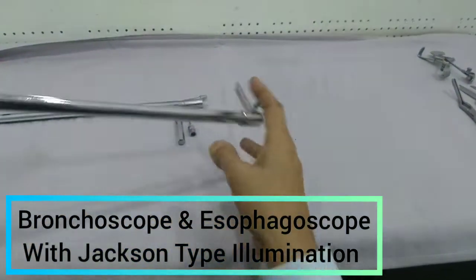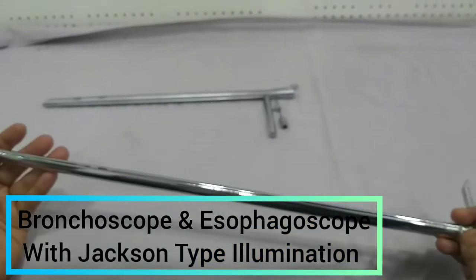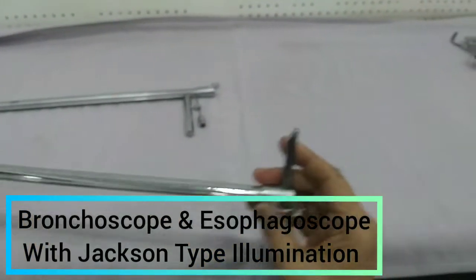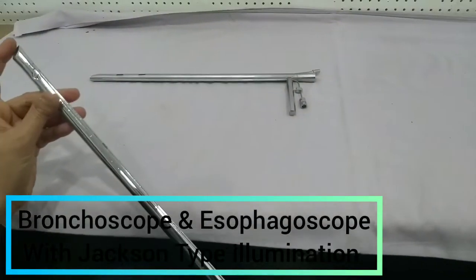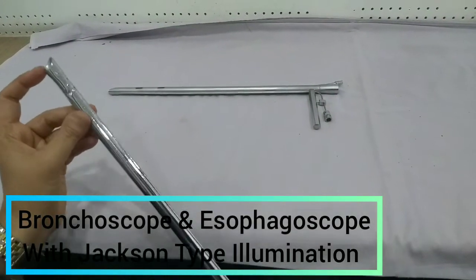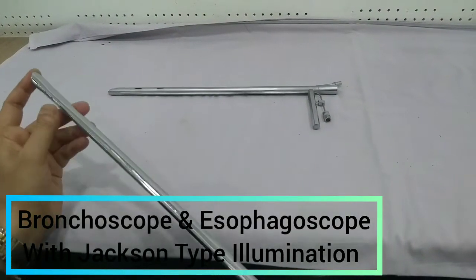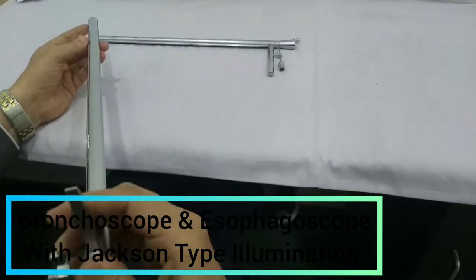This is the distal end and this is the proximal end. So in Jackson type, the illumination is at the distal end. And then you can see this handle — this handle will show us the direction of the bevel edge. So this lower end is beveled, and this handle will indicate the side of the tip.